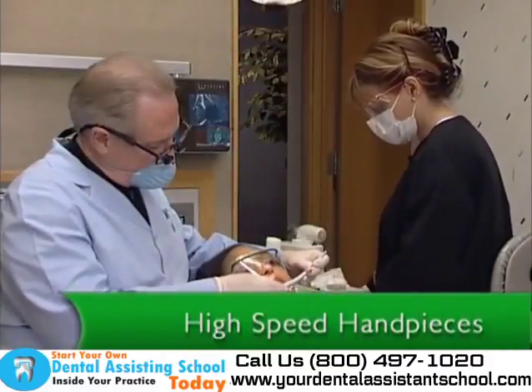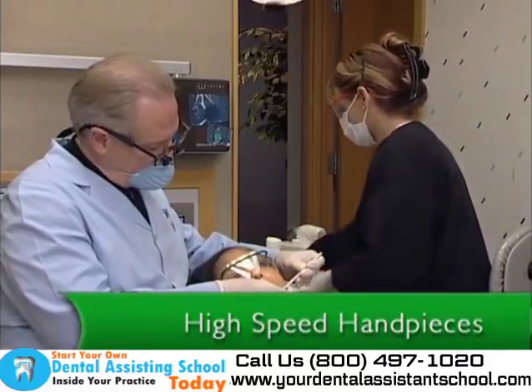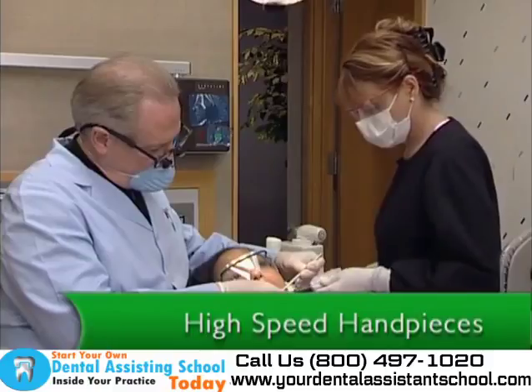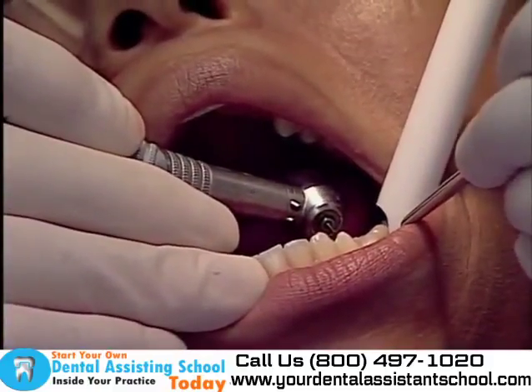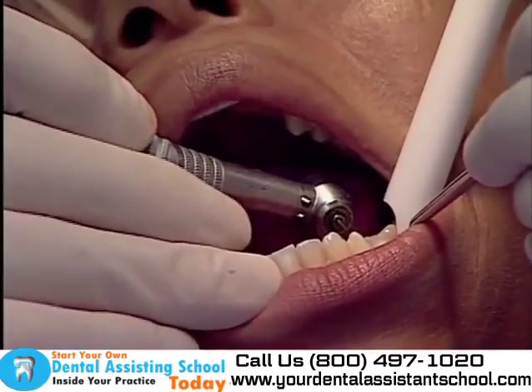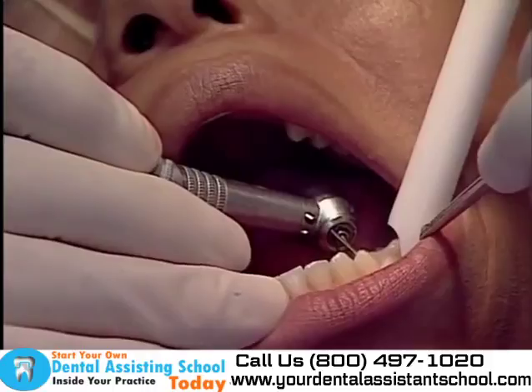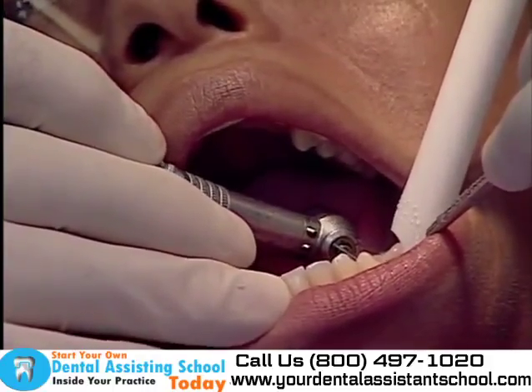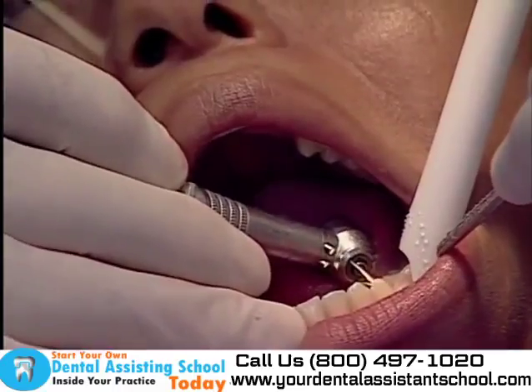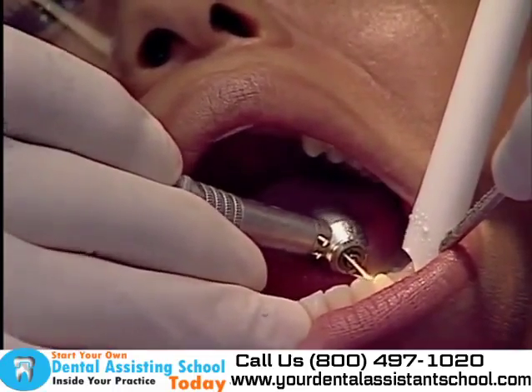High-speed handpieces are typically used to cut bone and teeth, to remove old restorations, and to finish new restorations. Due to the friction caused by the high speeds, heat is produced. The handpiece is equipped with a water coolant system, which, when activated, cools the burr by spraying it with water. It also may be equipped with a fiber optic light, which enhances the dentist's visibility.